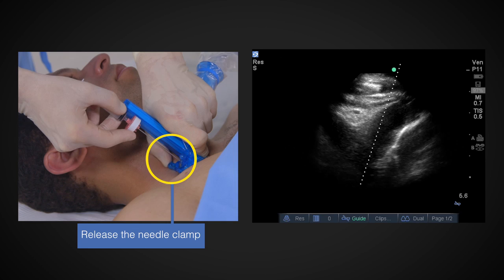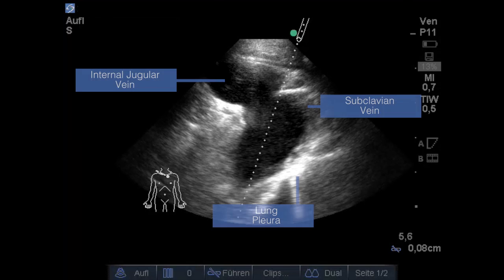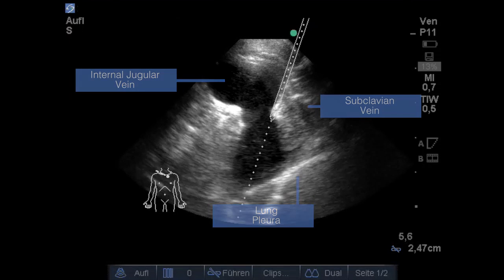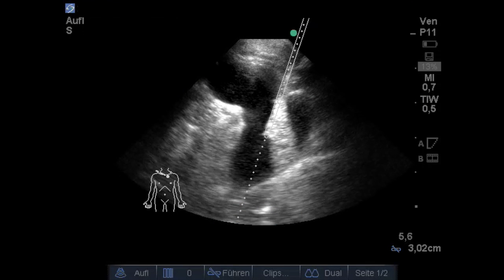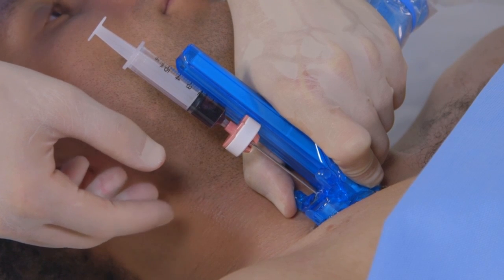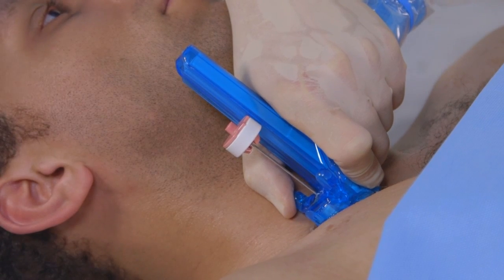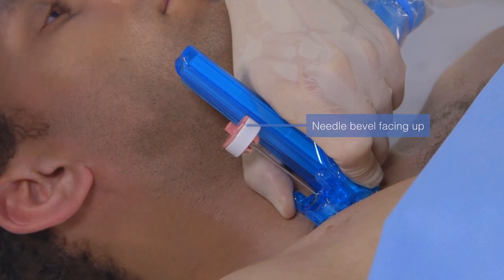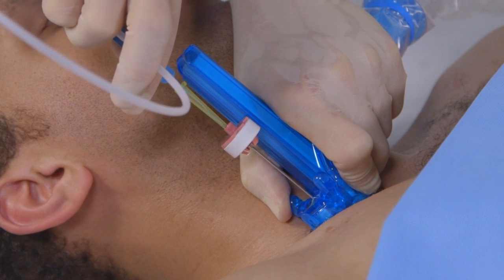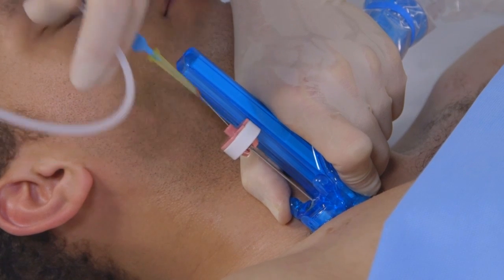Release the needle by rotating the needle clamp fully forward with the thumb to the open position. Then, while keeping the magnet against the magnet rail, advance the needle and observe the virtual needle cannulate the vessel, which is confirmed by blood flash in the syringe. Actuate the needle clamp with continuous gentle pressure to secure the needle tip in place. Pop the syringe off the needle by pinching the space between the syringe and the needle hub. Check that the needle bevel is facing up, and with the open side of the J of the guidewire also facing up, advance the guidewire. The guidewire entering the vein can often be observed in real time on the sonogram.